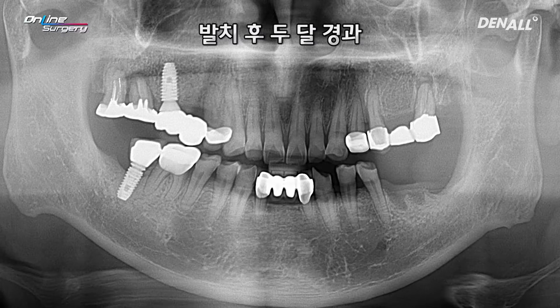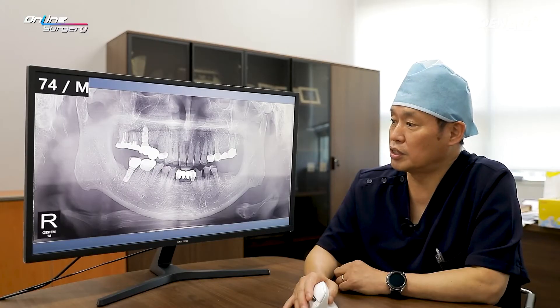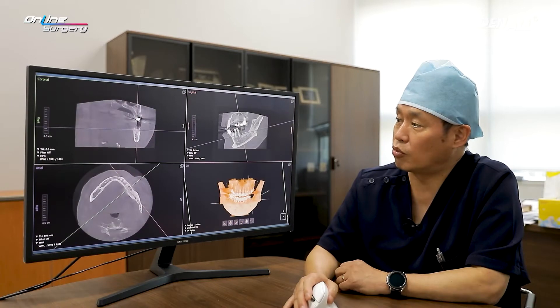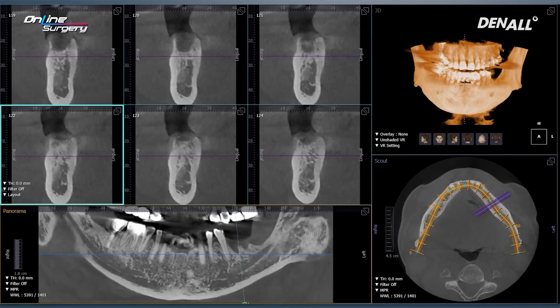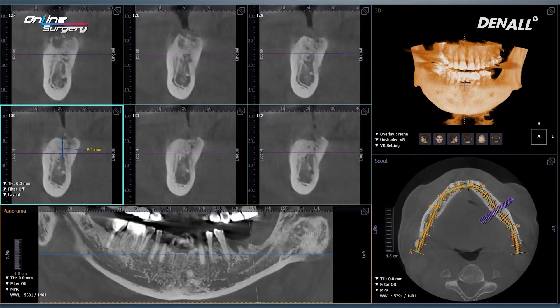I plan for implant placement using one guide. CT was taken. If you look at the CT image, you can see the extraction socket of number 36. There's no issue with the width and the amount of alveolar bone, and the height is okay as well. The extraction socket for number 37 is not fully healed, but the height of alveolar bone is okay.